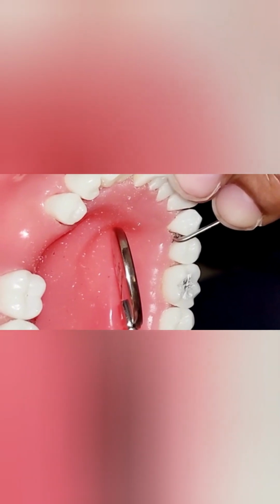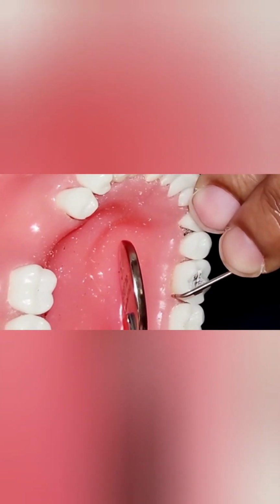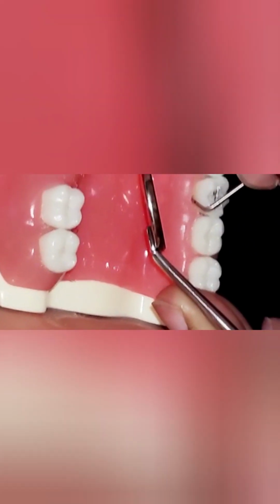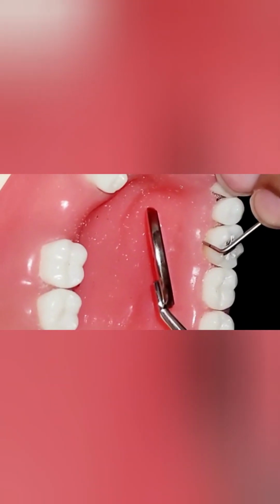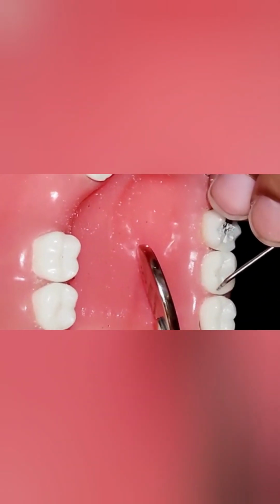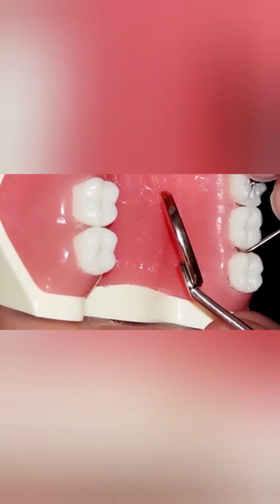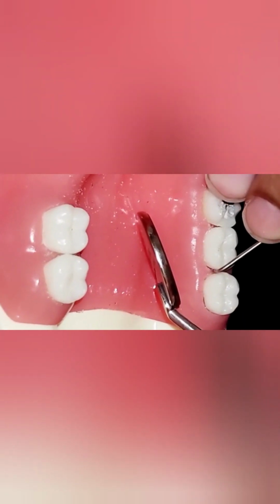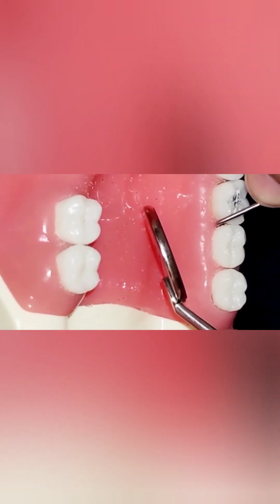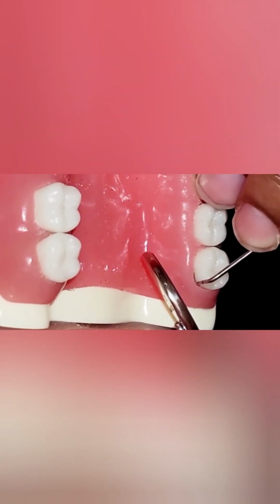8. 12. 9. 8. 12. Okay. Mm, 9. 8. 10. And our last tooth, number 32, lingual.